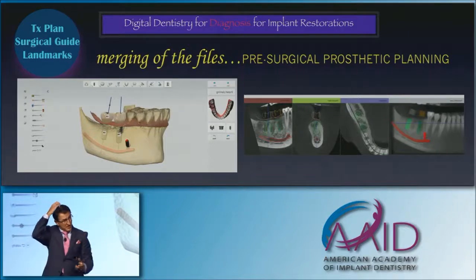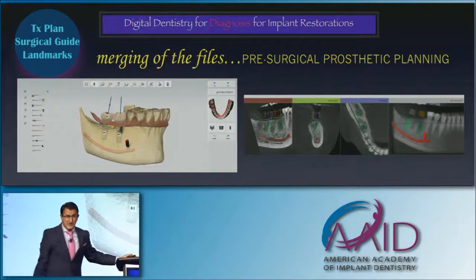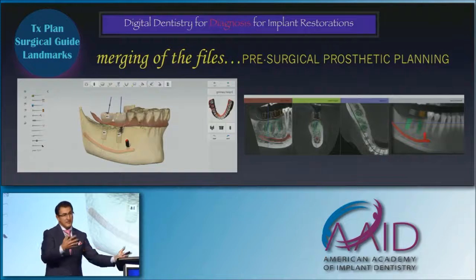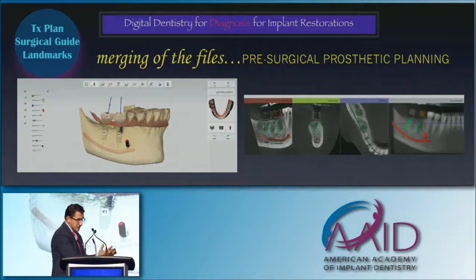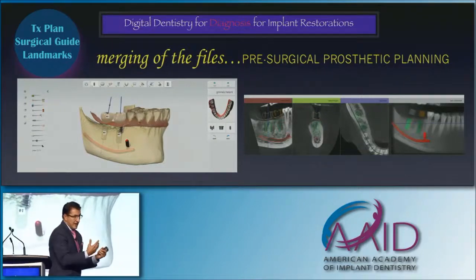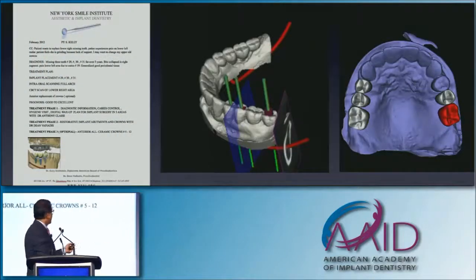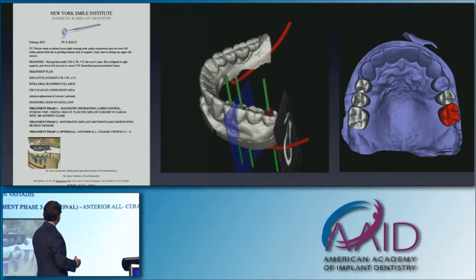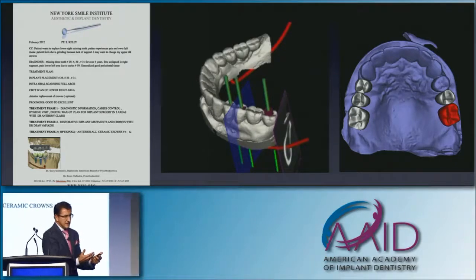We have patients that come in all the time. They said, oh, I hear you're very progressive and you have digital, and you could do implants in a day, right? And I say, well, not in your case. You need about a 2-year bone rehabilitation for me to even put an implant in. So a lot of times they're coming for certain things that they don't understand what they have. So having these tools to be able to show them visually, digitally on a screen, on a big screen, that helps the conversation go a lot easier. Again, giving them formats like this on their treatment profile so they can visualize with their treatment plan and their financials, it just makes it a lot easier.